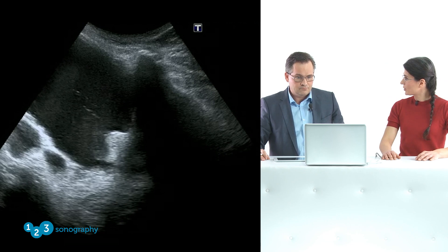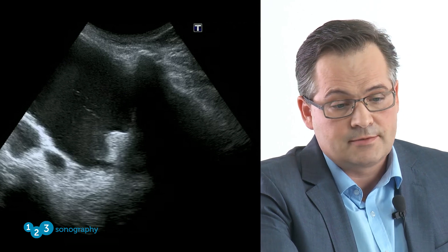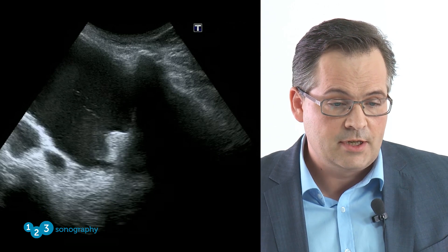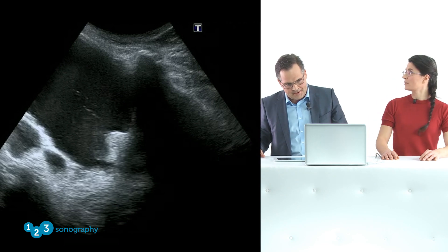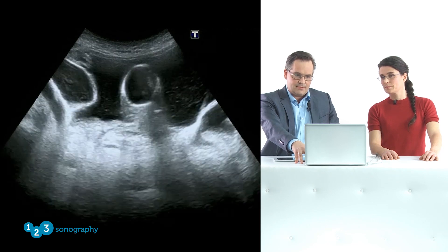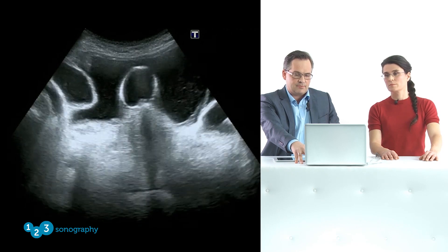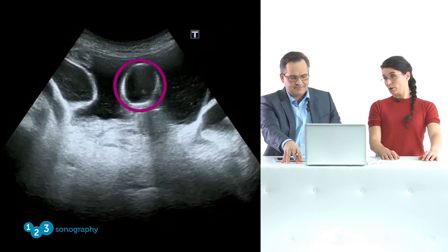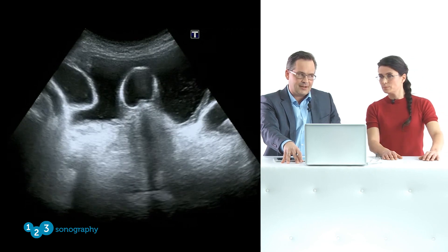But quite an easily made diagnosis with ultrasound, isn't it? It was clear. There had been dislocation and urinary retention and pain, of course, in the lower abdomen. So we had to do it again. You repositioned the urinary catheter, I suppose, as we can see here now. This was not really easy, because the patient also suffered from a remarkable hyperplasia of his prostate. But I can see beautifully the urinary catheter balloon here now. And isn't the bladder already getting a little bit smaller? Finally, we did it.